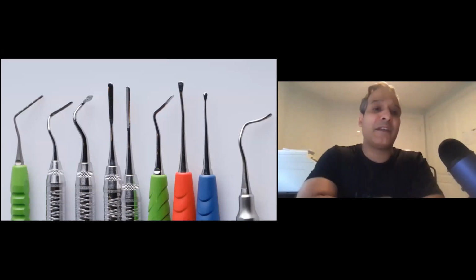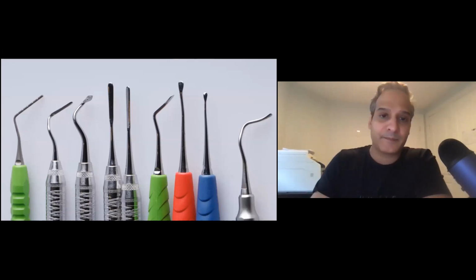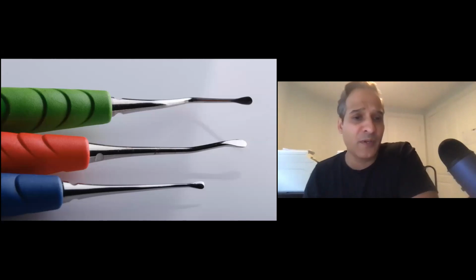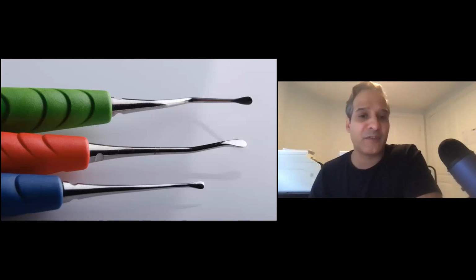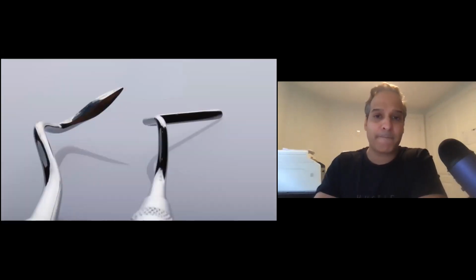For tunneling types of cases, I use tunneling instruments. These are some of the tunneling instruments I use. They're all different angles and shapes to get into all different types of sites and different anatomies. Here's just a close-up view. These are used to push through the sulcus and strip the tissue off the bone, allowing you to create a pouch or a pocket within the site.